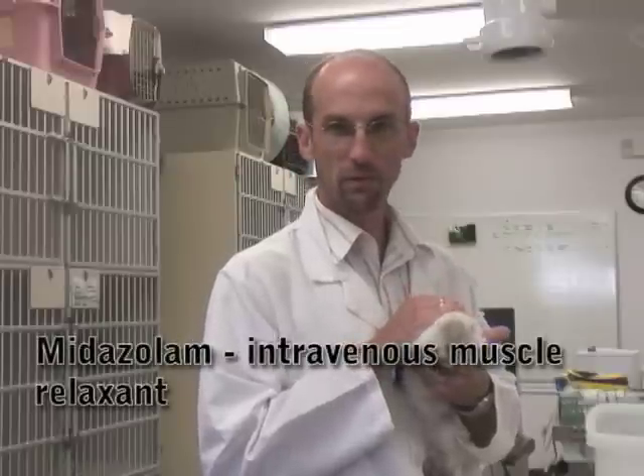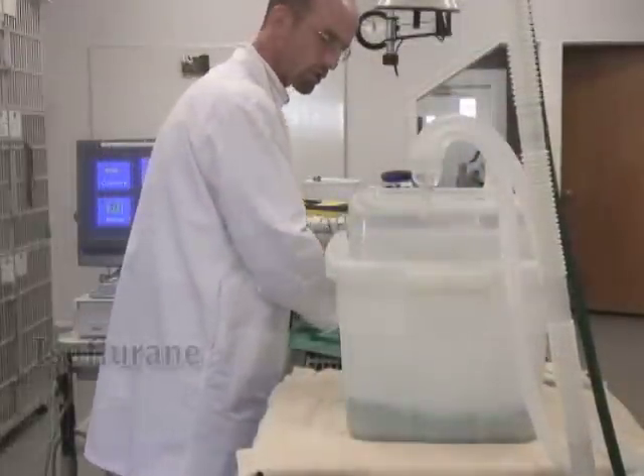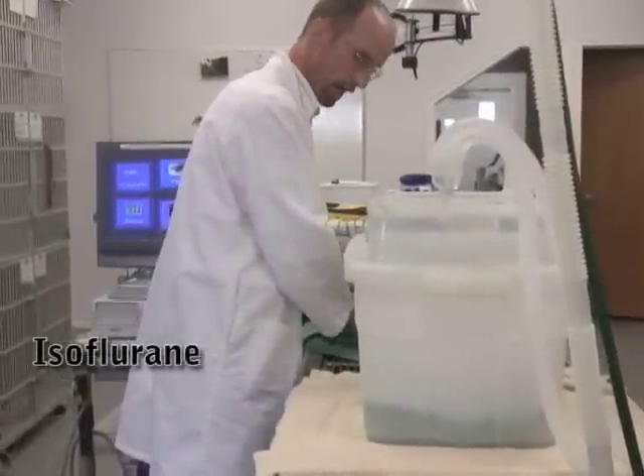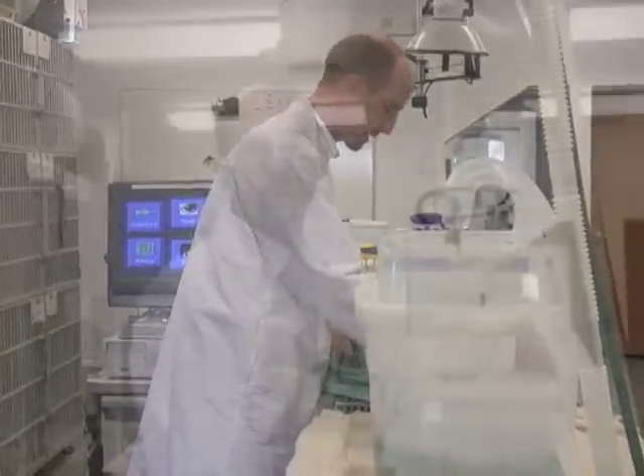We've already given her a little pre-medication called midazolam in the muscle, and now we're going to put her in a little box. We're going to give her some gas anesthetic. This anesthetic is isoflurane. It'll probably take maybe 10 minutes or so, maybe not that long, but about 10 minutes.